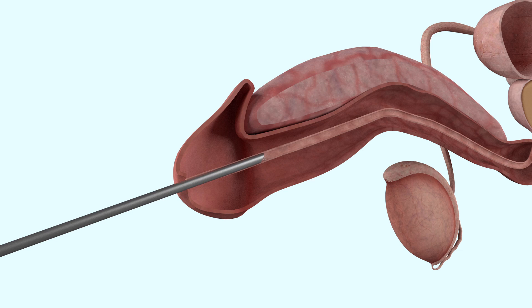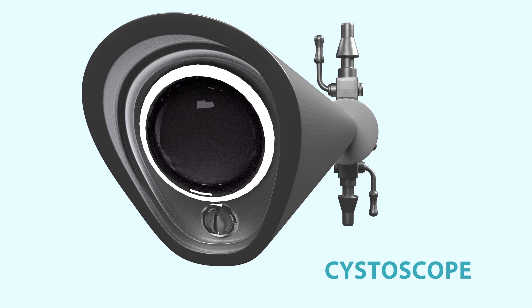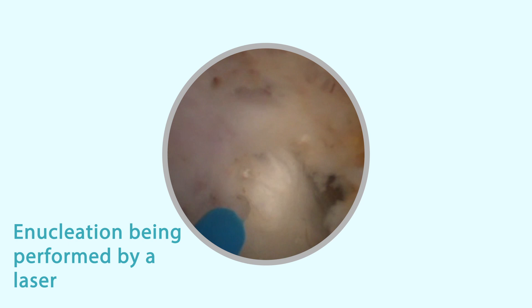A small telescope called a Cystoscope is inserted down the urethra and into the narrowed section of the prostate gland. A laser fiber is used to start detaching the inner part of the prostate, taking care not to damage the surrounding structures.